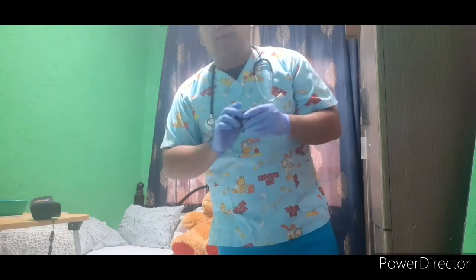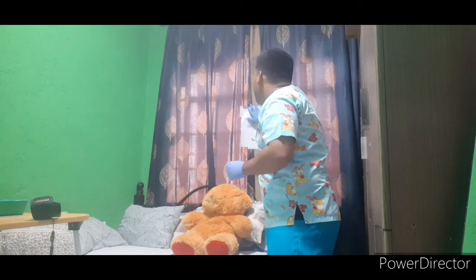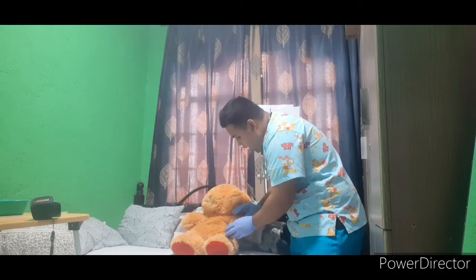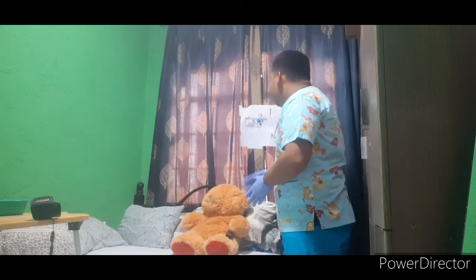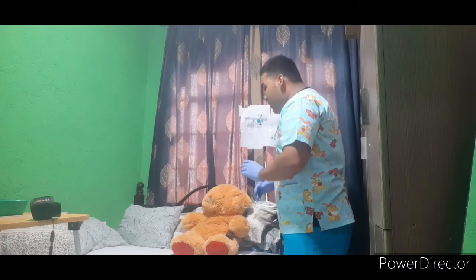Next, we have to check the oxygen saturation of the patient using the pulse oximeter. We will place it on the fingernail — on the index finger, middle finger, or ring finger. The result will come in 1 to 8 seconds. The patient's oxygen saturation is 88%, which is below the normal range of 95 to 100%. This low reading indicates that the patient is having difficulty breathing, which is why suctioning is needed.